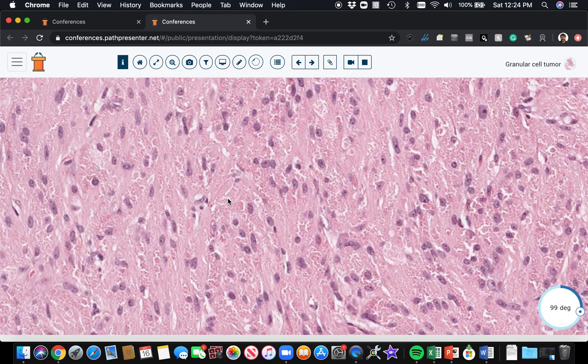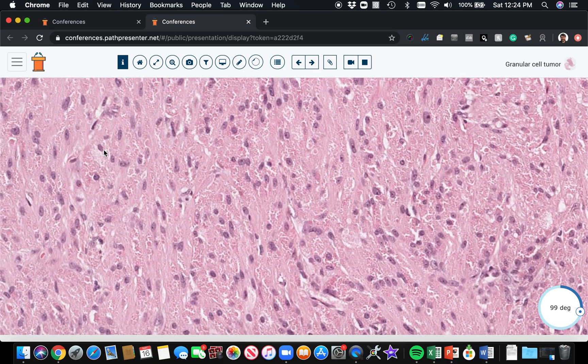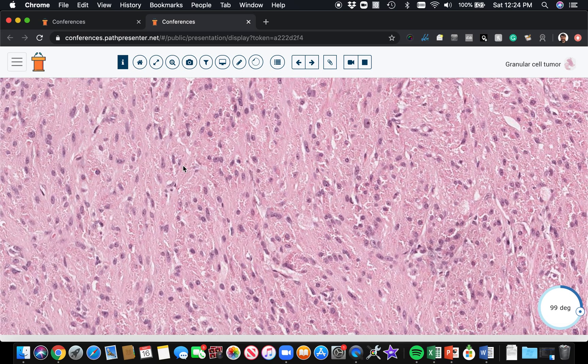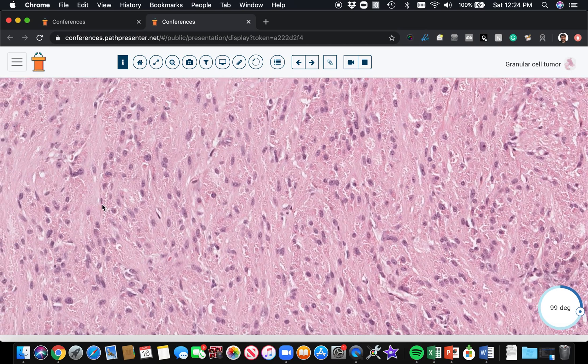We often talk about CD68 as though it's a specific histiocyte marker, but that's not true. It stains pretty much any cell that has phagolysosomes in it, which of course histiocytes do, but so do granular cell tumors. The classic staining for granular cell tumor is strong expression of CD68 and S100 because these are nerve sheath tumors. They're just an unusual variation of nerve sheath tumor. So S100 and CD68 positive. PAS often stains these granules.